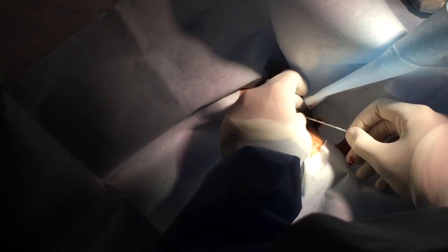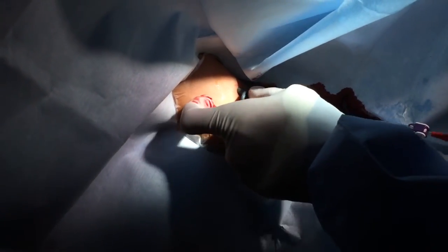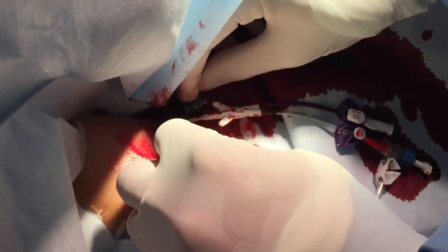Here comes the midline. It's already been stiffened, and the wire has been made sure not to protrude from the tip. Midline's getting advanced. Not all the way. We'll leave out a few centimeters so we can break our dilator. There it goes. In. Yep, nice and smooth. Okay, pull the dilator out.